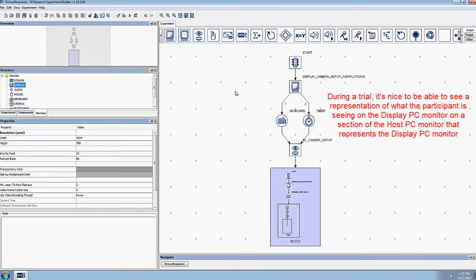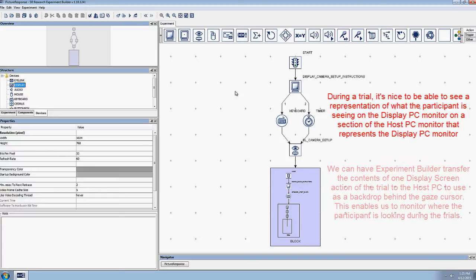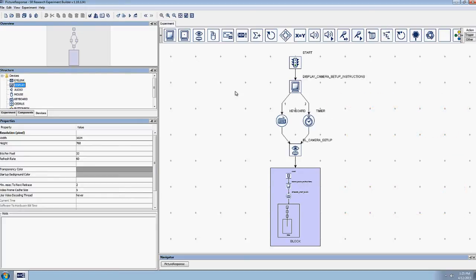Next, during eye movement recording, it's nice to see a representation of what the participant is viewing on the display PC in the section of the host PC monitor that represents the display PC monitor. We can have Experiment Builder transfer one display screen action of the recording sequence's contents to the host PC to use as a backdrop behind the gaze cursor so that we can monitor where the participant is looking during the trials.